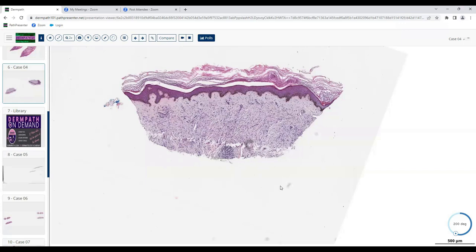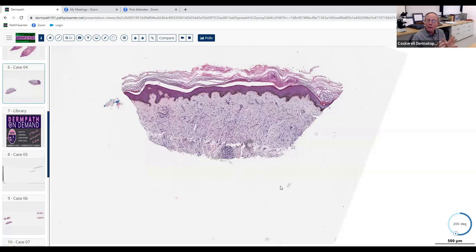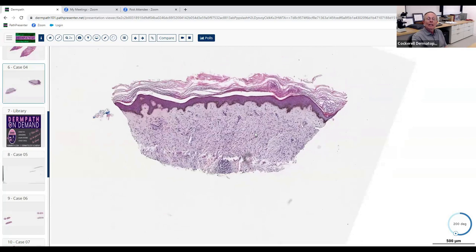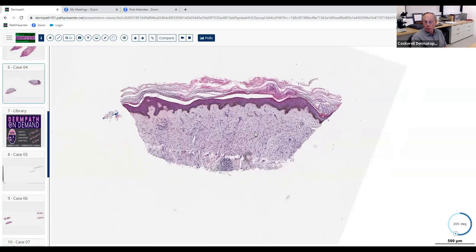They look kind of like a whorl pattern, and maybe interstitial? Yes — interstitial, meaning they're intercalating between and among the collagen bundles. Some of them are almost forming little quasi-schools of fish — some going this way, some going that way, splayed between collagen bundles. Before we go to higher magnification, what diseases can give you an interstitial pattern at low magnification?